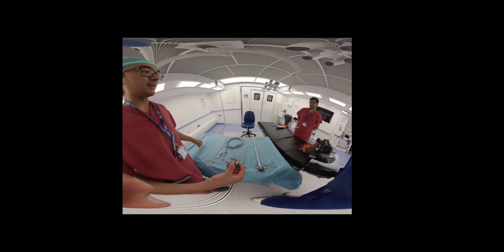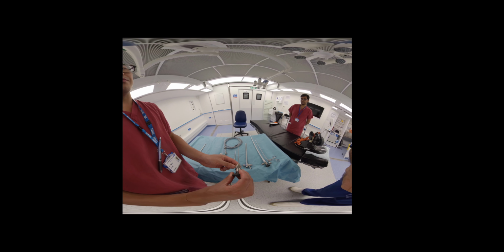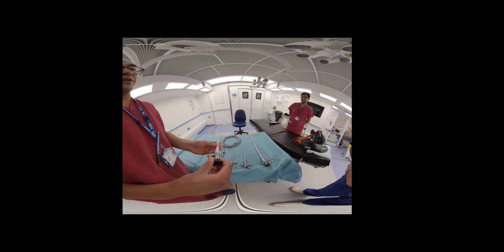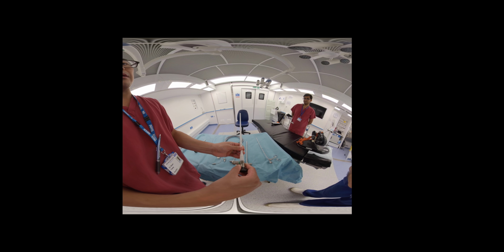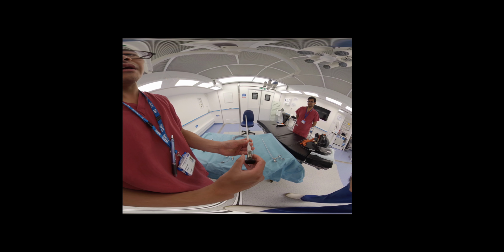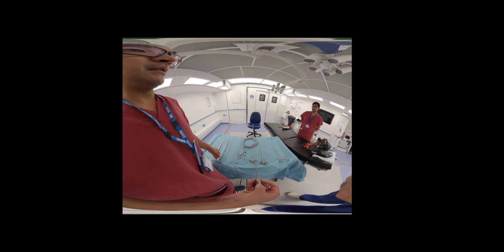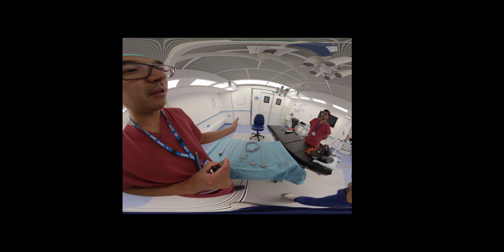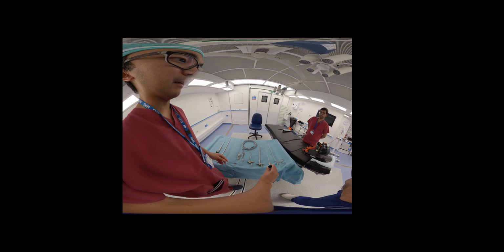Okay, they're very delicate because they're quite thin, but that's a 0-degree Hopkins rod there, and they've got different diameters and lengths as well. For this video, we'll use a larger one because it's slightly more robust and you'll be able to see it easier. So again, this is the larger diameter and length, 0-degree, it will say there, which means the lens looks directly out. Okay, so what you're seeing is directly in front of you, and there's no angle on it. Okay, and that's that there.